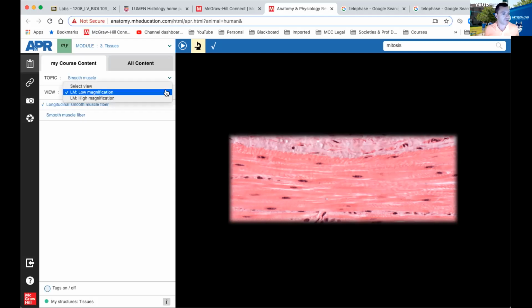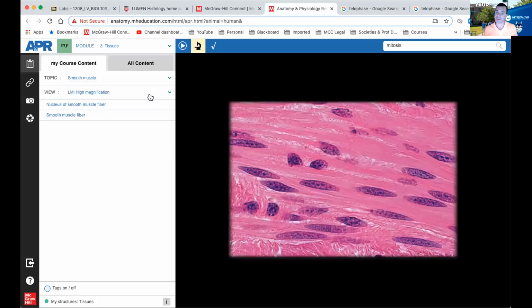But for you guys, I'm going to put it probably on this one so you can see it a little bit better. Okay? Because I'm going to assume this is the first time most of you are seeing tissues. You don't really sit around and look on Instagram at tissue slides, I'm going to imagine.